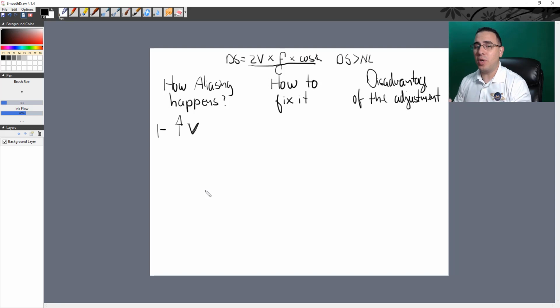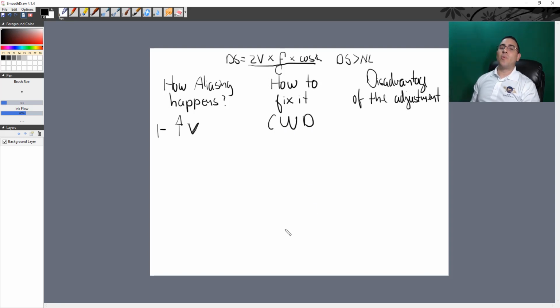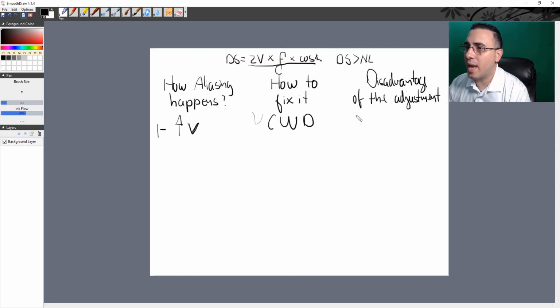But when the flow is extremely fast, with a high velocity that pulse wave Doppler cannot measure, you have another option, especially when you're working in cardiac. You can use continuous wave Doppler. Because the wave is continuous, there is no pulse repetition frequency, and if there is no pulse repetition frequency, there is no aliasing. So continuous wave Doppler is never going to give you aliasing. One disadvantage of continuous wave Doppler is that it doesn't have a sample volume.